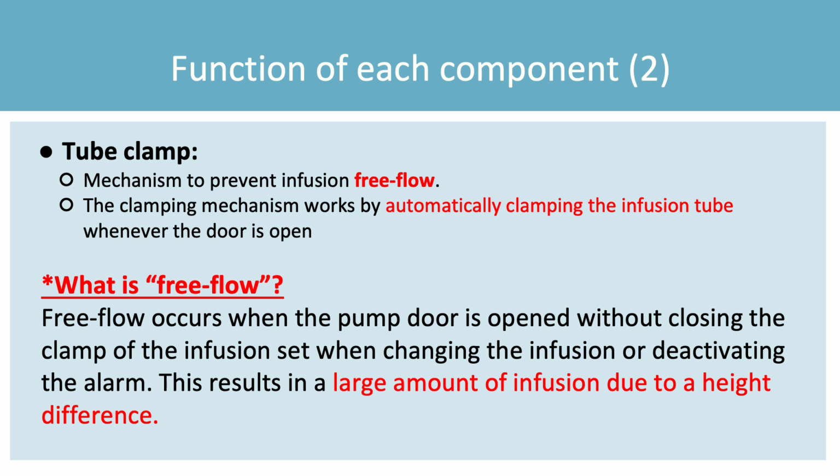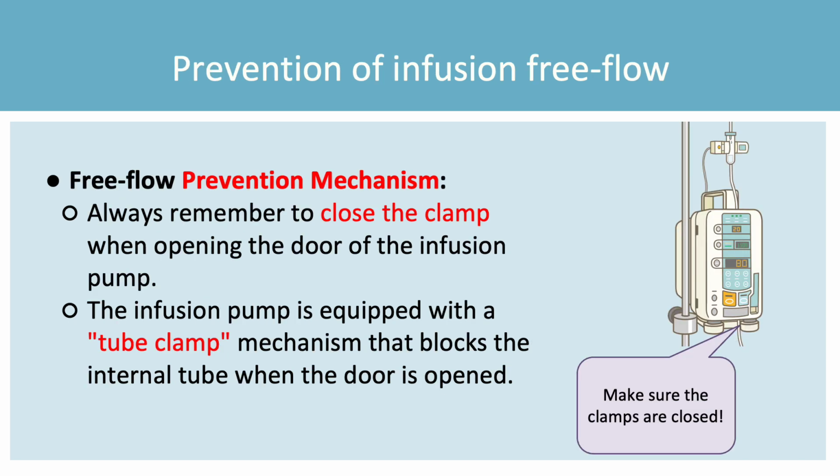Free flow occurs when the pump door is opened without closing the clamp of the infusion set when changing the infusion or turning off the alarm. The free flow causes a large amount of infusion due to a height difference. As a preventive measure, always remember to close the clamp when opening the door of the infusion pump.